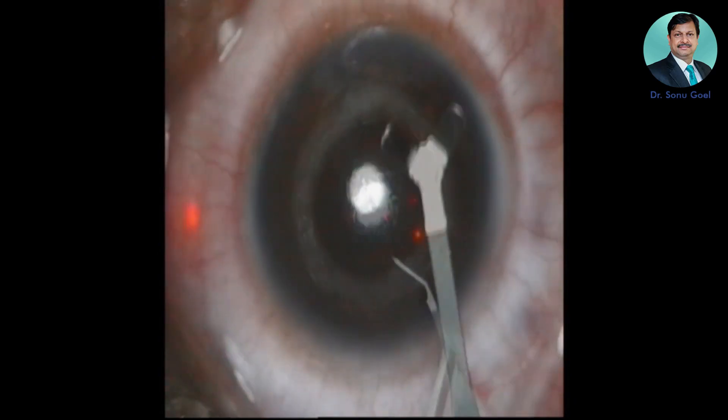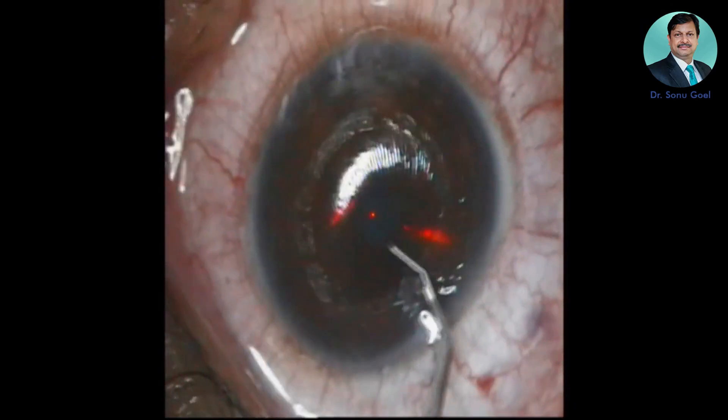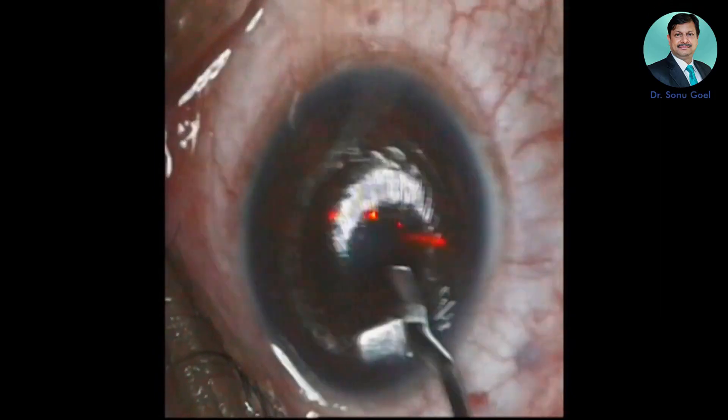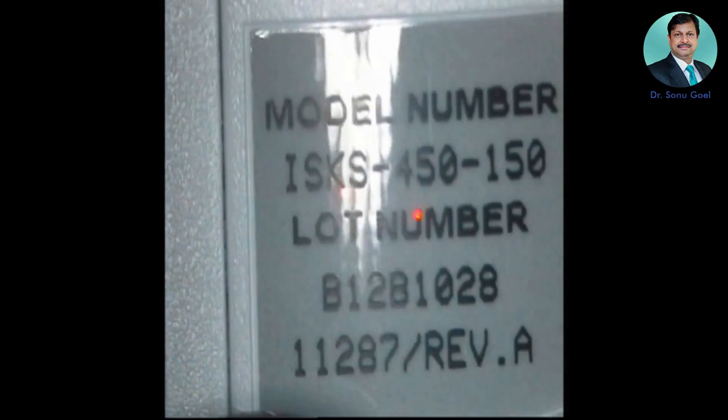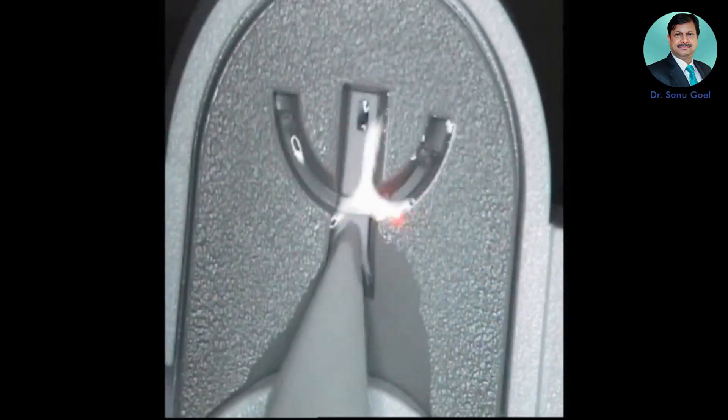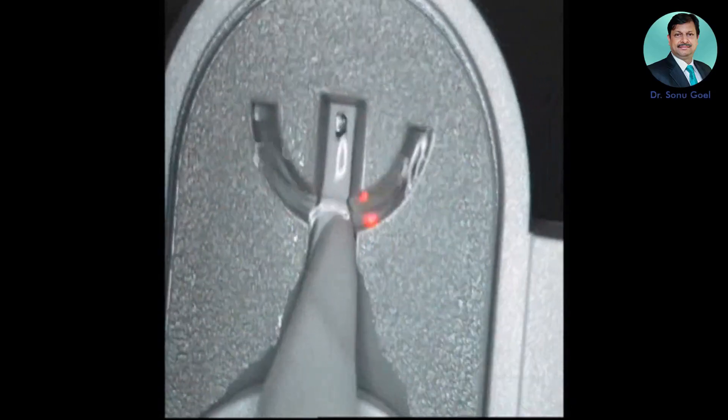The tunnel opening is opened up with a specialized wire manipulator. The trick is that you have to go in the right depth, otherwise a false track can be created. You have to go first vertically and then negotiate horizontally to insert the intacs.